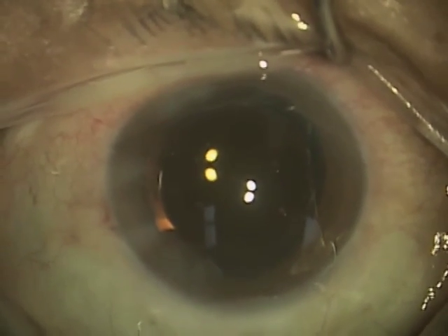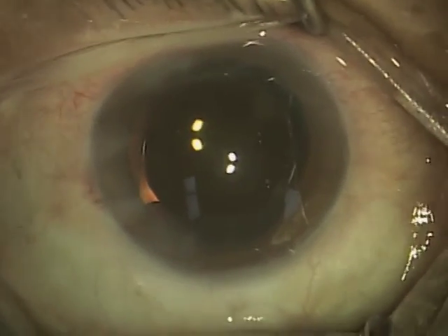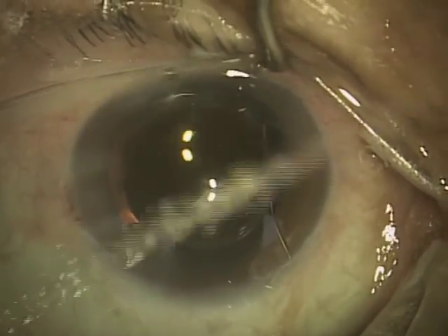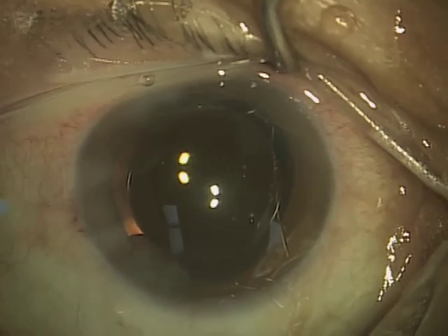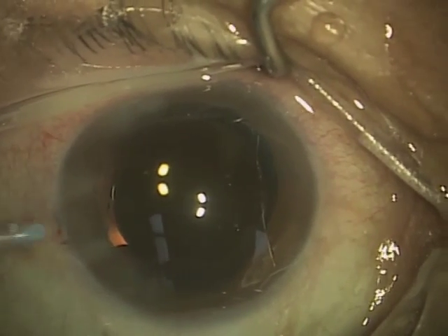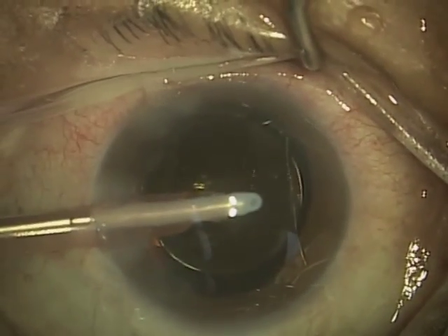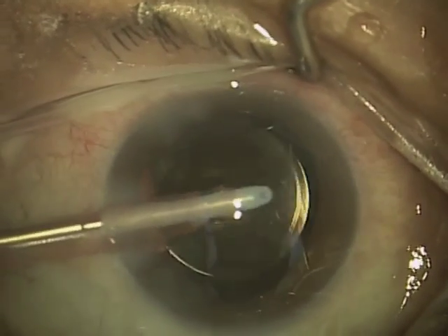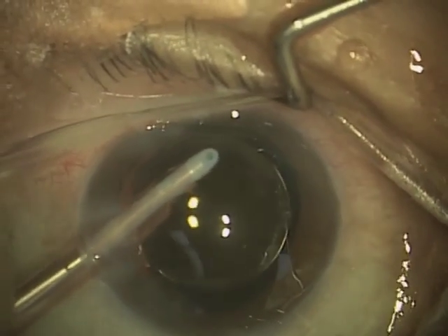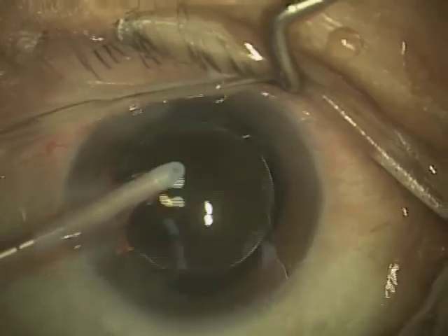That's actually going to help the lens stay in good centered position as the capsular bag heals around it. So at this point, I am going to remove the viscoelastic material because it's no longer needed. It's done its job of protecting the corneal endothelium and allowed me to safely insert the lens into the eye. This here on the left, you see the coaxial irrigation and aspiration handpiece, and I'm aspirating or removing the viscoelastic material from the eye.